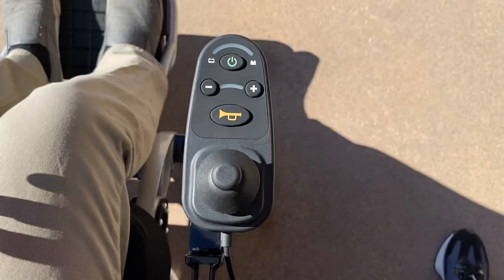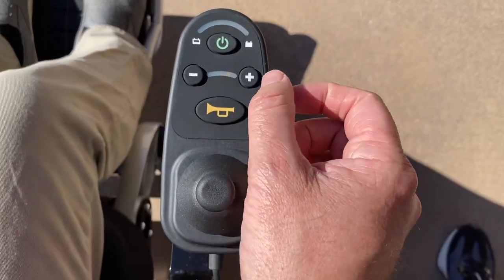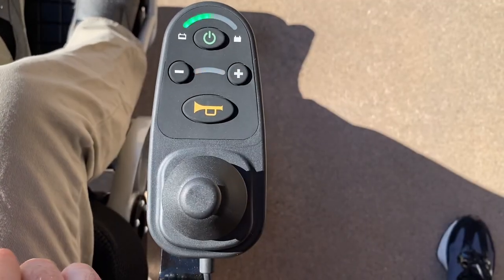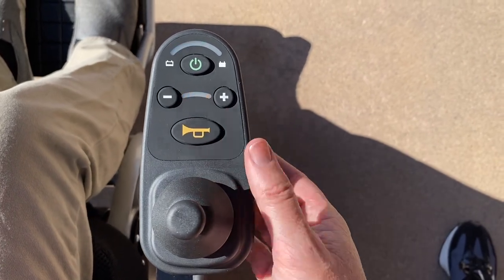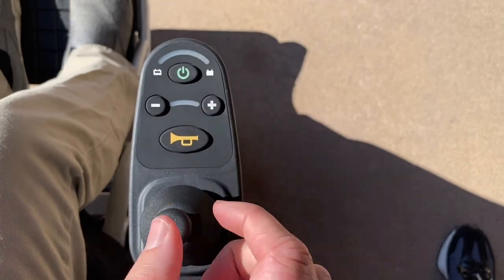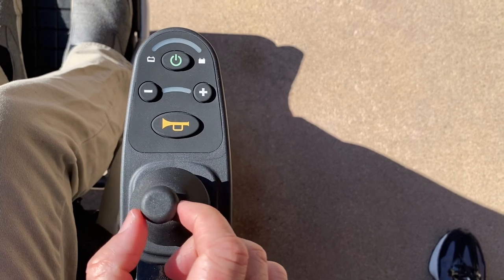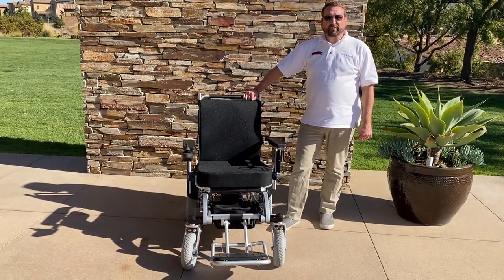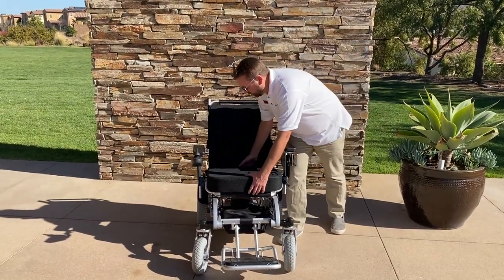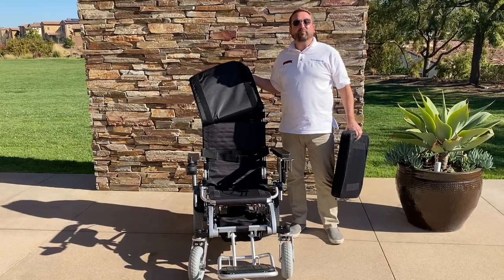The joystick is very user-friendly. To turn it on, simply press the green button — that is also the battery indicator. We're currently at about half charge. The plus button accelerates, minus decelerates, there's a horn, and the same button turns it on and off. To operate: turn right to go right, left to go left, back to go back, forward to go forward. It turns on a dime and can do a 360. Like all Ranger series models, this chair also comes with removable, washable, and breathable seats and cushions.